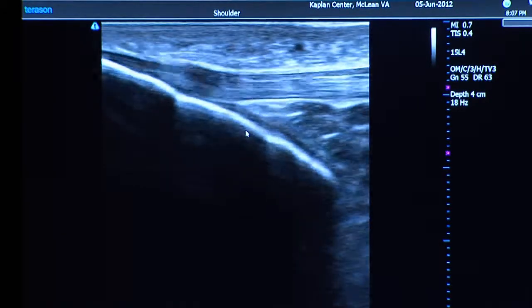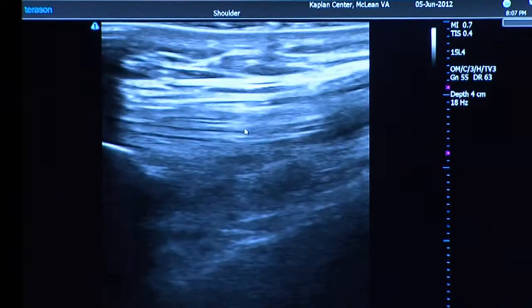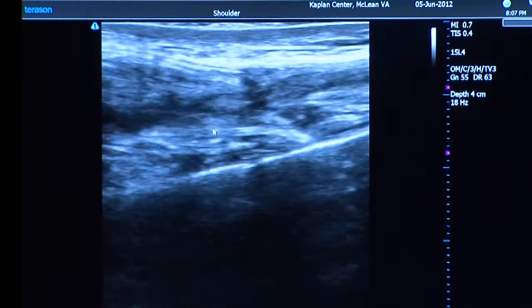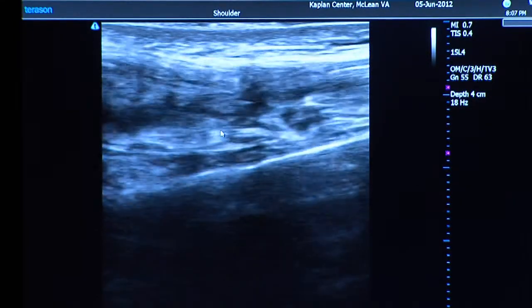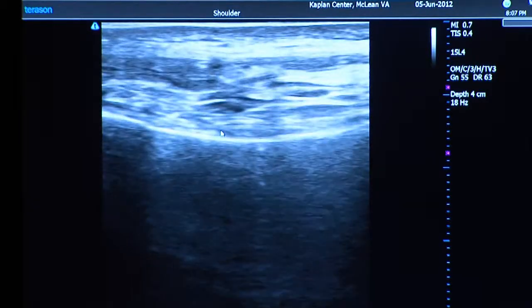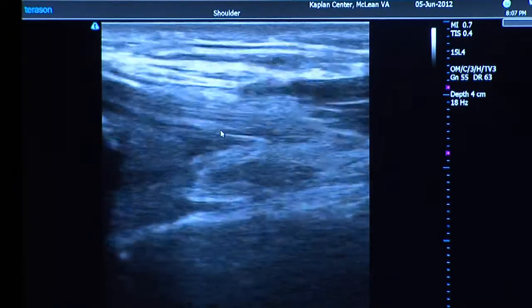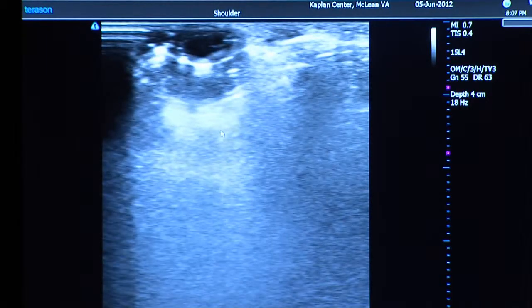The other thing we can see is fluid. When there's fluid in the knee it usually hangs out in this area right here, and fluid appears dark — almost black. I'm not really seeing anything there, so it looks all right. Fluid is a sign that there's been injury to the knee, but the fluid itself doesn't cause a problem unless you have a huge amount of it.